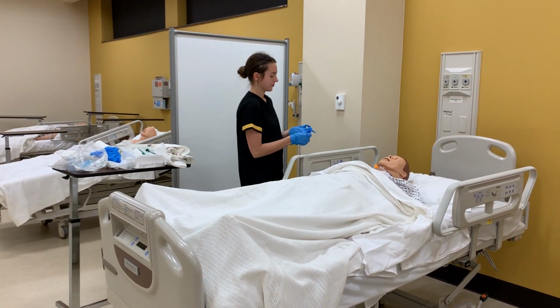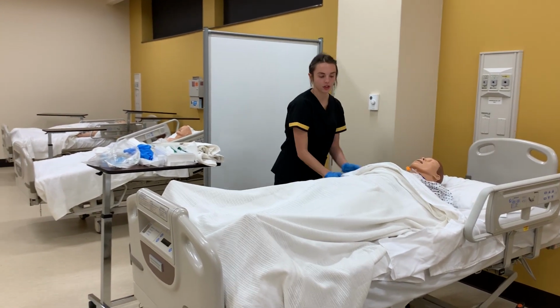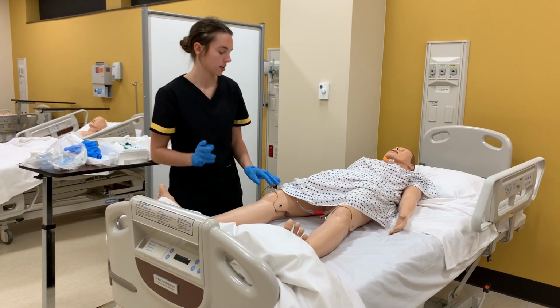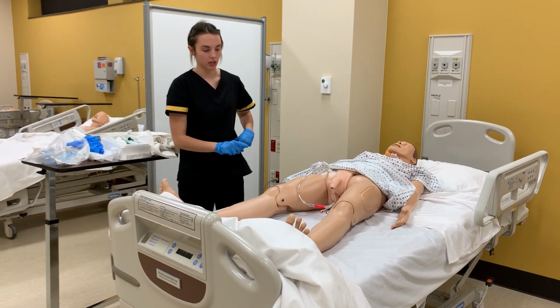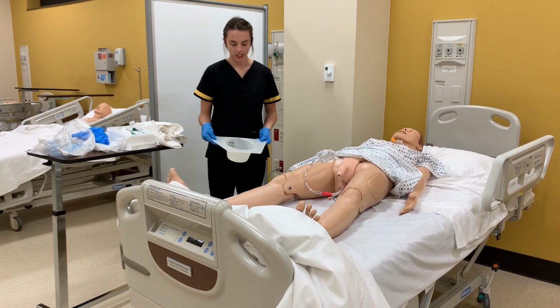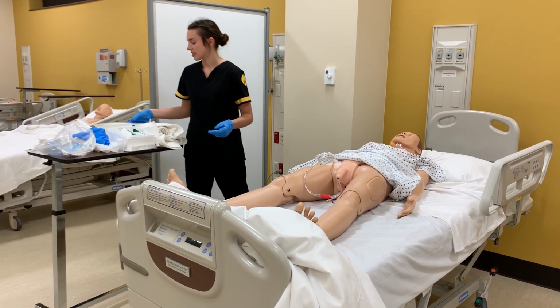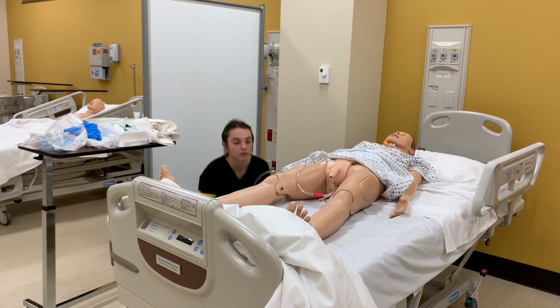Put my gloves on. Okay. So let me just uncover you. And just removing it is just a clean procedure, so I won't have to do any sterile gloving or anything. So, here we go. And before I do take it out, I would empty the entire bag the same way that we just did, clean it with the alcohol before and after, and then just however much urine is in it, get it out of the bag so that none of it would flow back in once we pick it up to remove it.